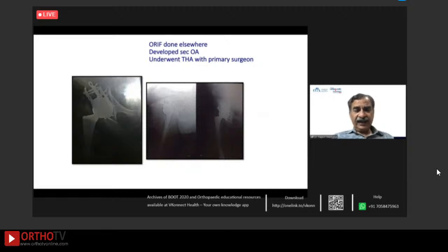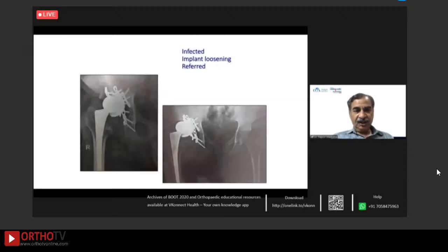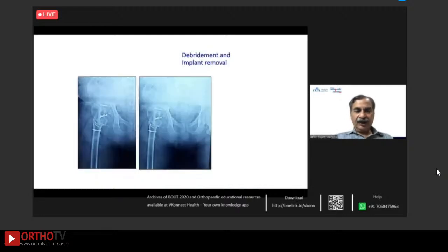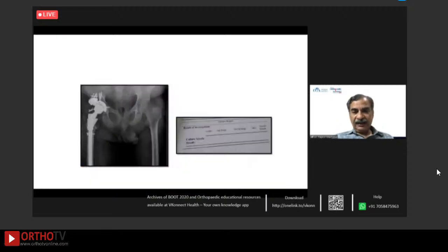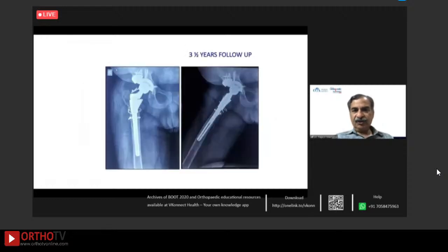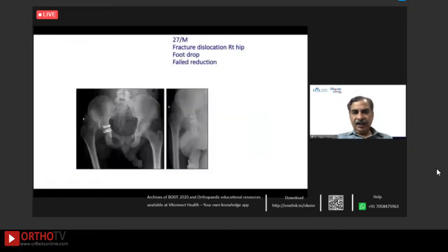He had an ORIF done somewhere else, developed secondary osteoarthritis, underwent total hip with the primary surgeon, and surely enough, it got infected, an implant was loosened, he had a permanent pacemaker put in, which was infected. So there was a focus of infection. It was very difficult to take out. So debridement and implant removal was done after the pacemaker was taken out because that was the focus of infection, infection control. And this was the definite reconstruction. And this was the follow-up x-ray.